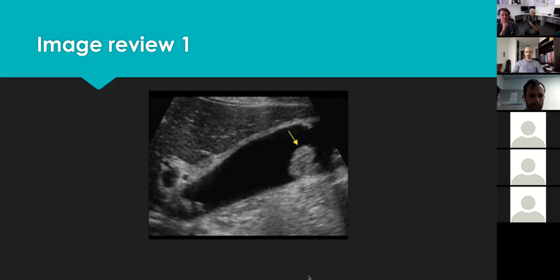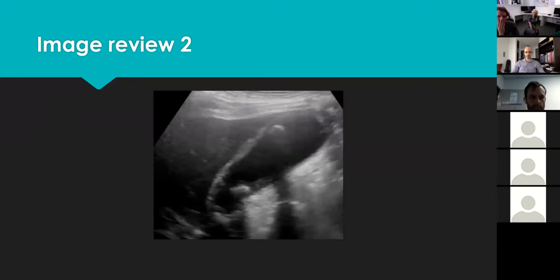And if you're thinking about a possible polyp and we cannot move the patient to see if it's moving, what can we do? Put color Doppler with a small gate, low velocity detection, to look for blood flow in a polyp and none in the sludge. Perfect. And with that color Doppler, obviously, we would need to reduce our scale and increase the gain to see a small field. Perfect. Now the next one, Vishal, do you want to comment on this?